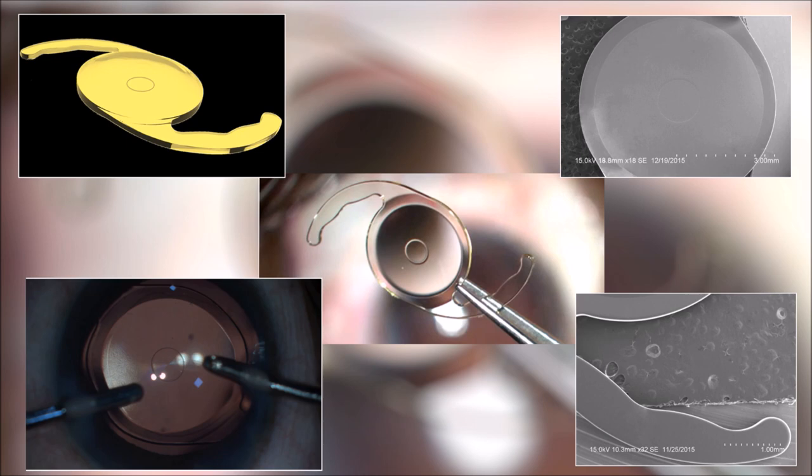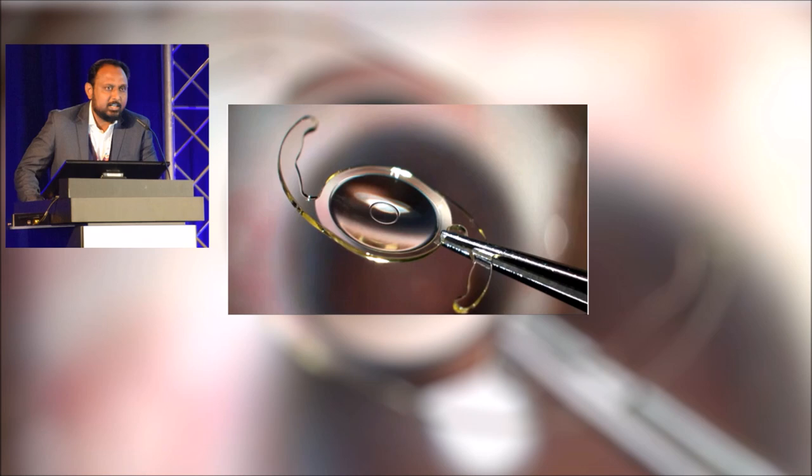The advantage of this optical design is that it gives clear distant vision, good intermediate and acceptable near vision with minimum to no halos, without the loss of contrast sensitivity, as the dispersion of light is minimal when compared to multifocal IOLs.